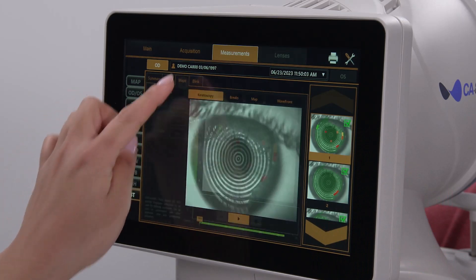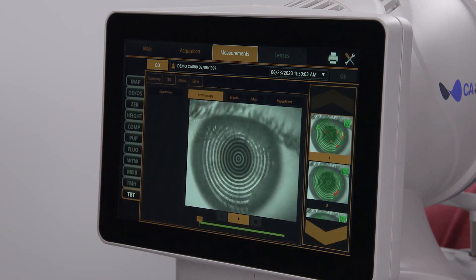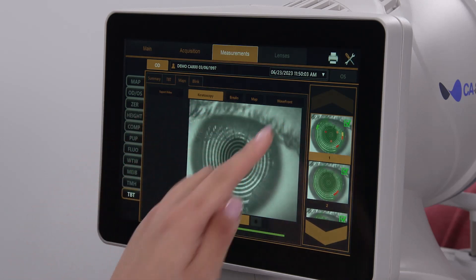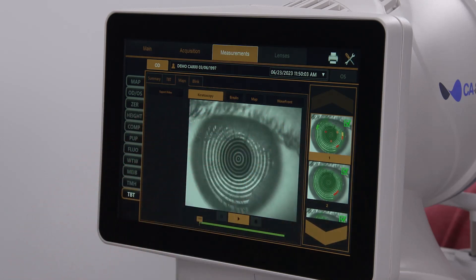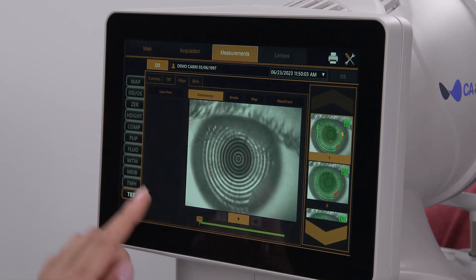The Maps tab allows you to play back a recording of the selected acquisition with a choice of overlays. You can choose to examine the effect of tear breakup on the placido disc rings, the breakup sector grid, the topography map, or the anterior corneal aberrations by selecting from the tabs at the top. Keratoscopy playback shows how the placido disc rings distort and break as the tear film breaks up.